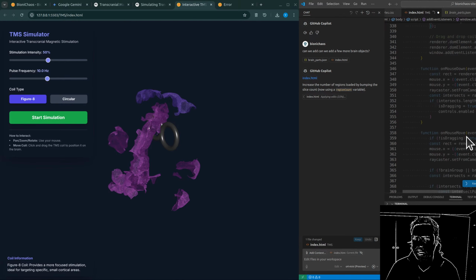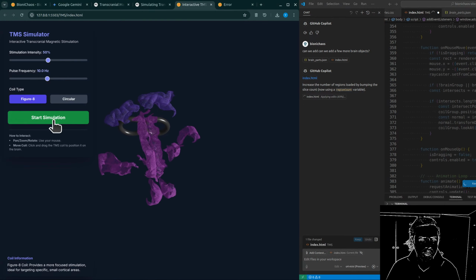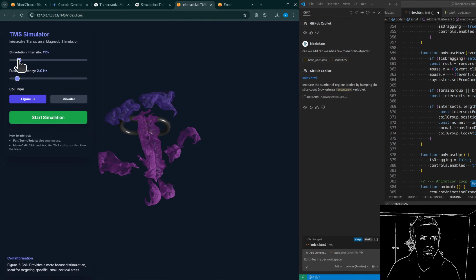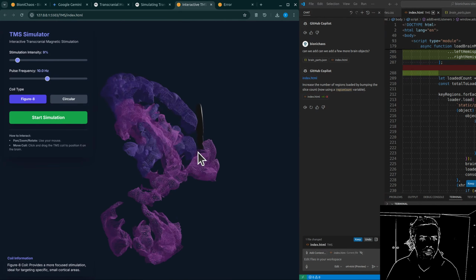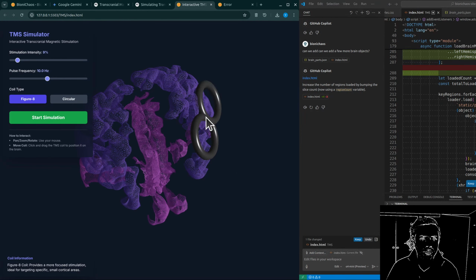Wow. So you can simulate if one specific virtual neuron sitting in a particular spot with a certain E field hitting it would actually activate. Pretty much, yeah. It gives you that fine-grained view. But, as you know, the brain isn't just isolated neurons floating around. It's all connected. It's a massively interconnected network. So the other approach is network-level modeling. This shifts the focus to simulating interconnected groups of neurons or even larger-scale brain networks.